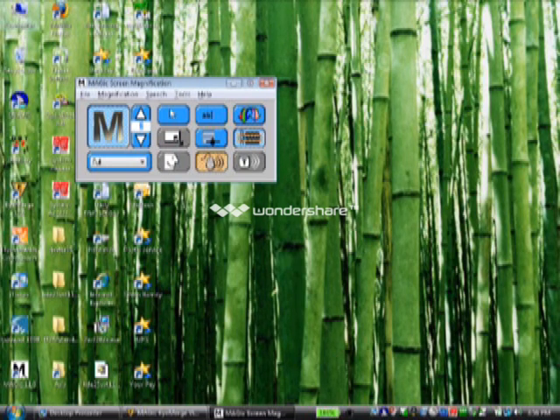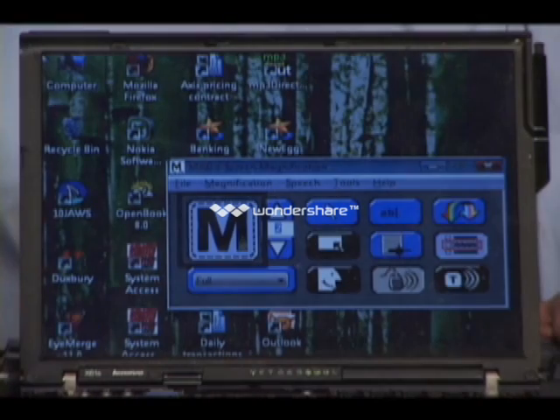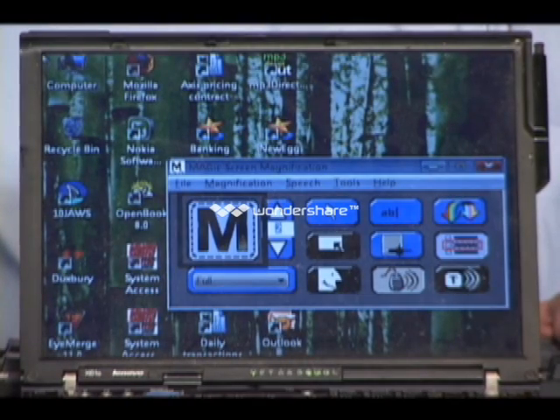It lets me demonstrate a screen enlarging program when I can't see it. There are a couple of advantages to that. Granted, I wouldn't do it with this little laptop of mine which has a 12-inch screen. I don't recommend this because if you have low vision and you split this screen and you've enlarged it with Magic on one half and you've got the CCTV on the other, you're taking up an awful lot of real estate and you don't have that much to go with. And so I suspect we wouldn't ordinarily use a 12-inch laptop screen for this, but today we have to because it just would not be practical.